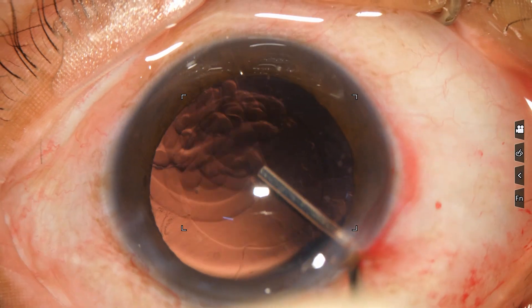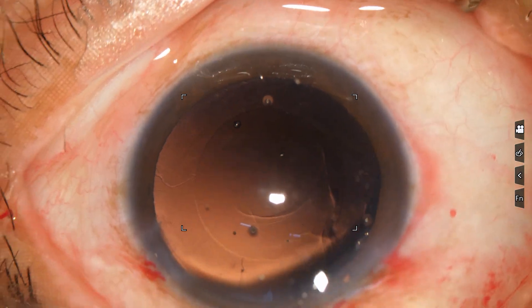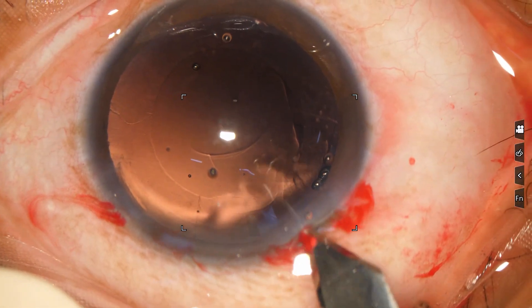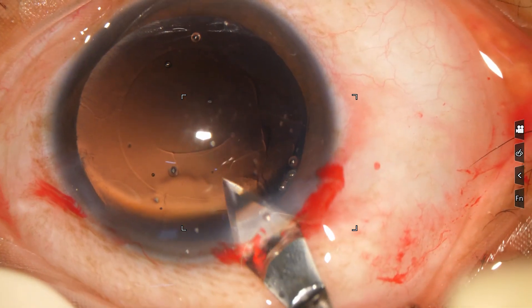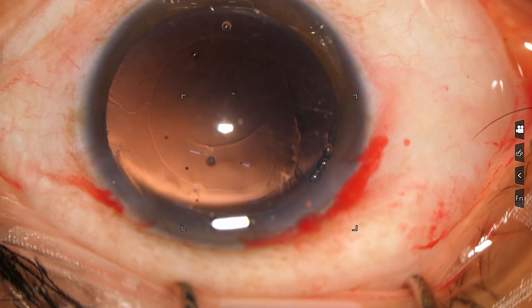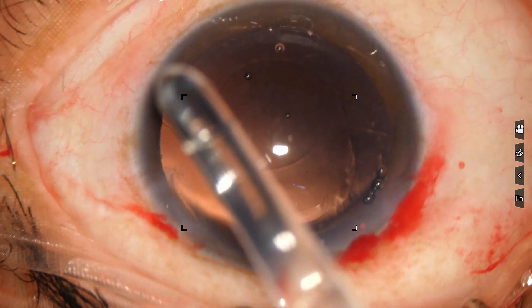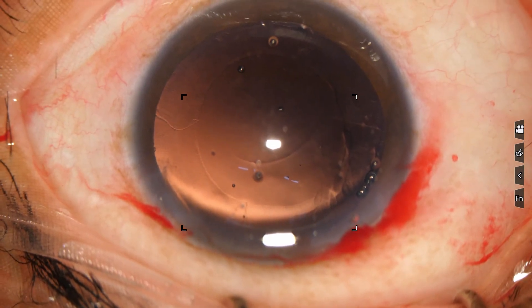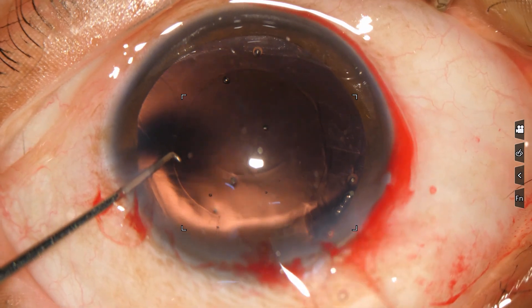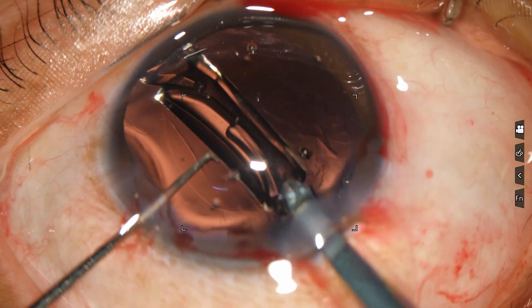Now the anterior chamber and the capsular bag are filled up with viscoelastic. The main wound is enlarged a little bit — the size of the main wound becomes about 3 mm. Then a hydrophobic, acrylic, single-piece, monofocal intraocular lens is implanted in the capsular bag.